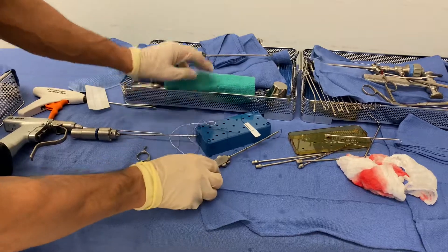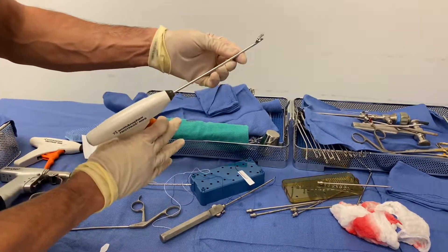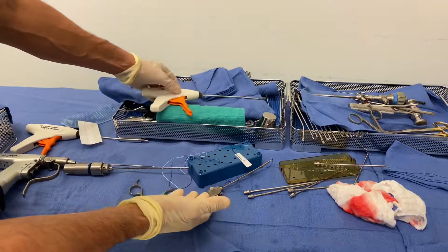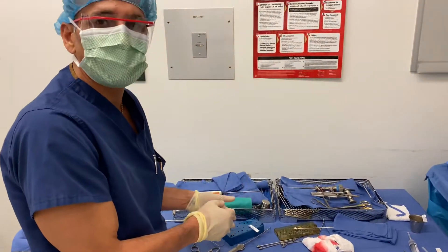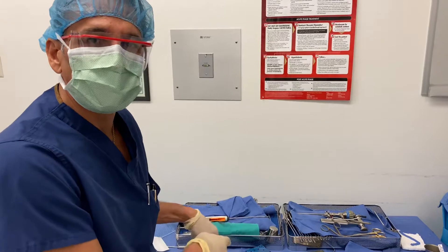My initial go-to is this particular device, the Smith and Nephew mini first pass, because it's low profile. But even though it's low profile, sometimes you cannot open the jaws and you have to have a backup — and sometimes you need a backup to the backup as well. Whatever it takes to fix it. If you don't fix the root, the patient's going to end up getting arthritis. I'm showing you my technique. Thank you.